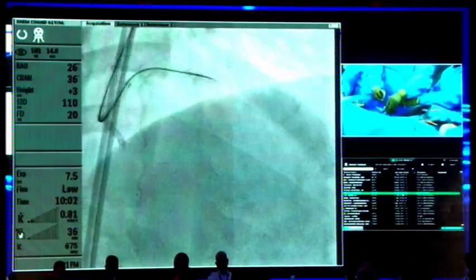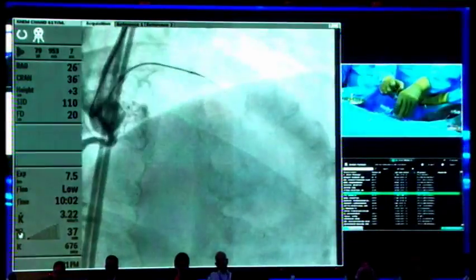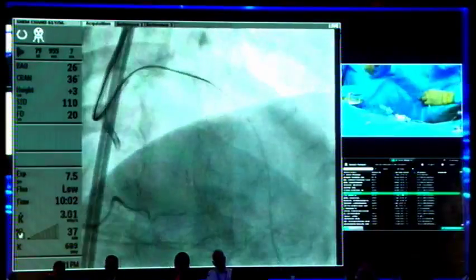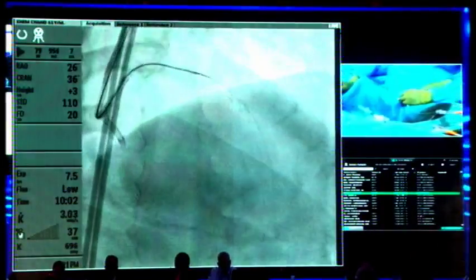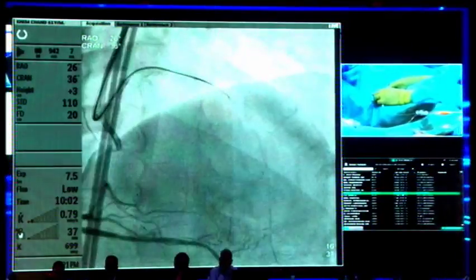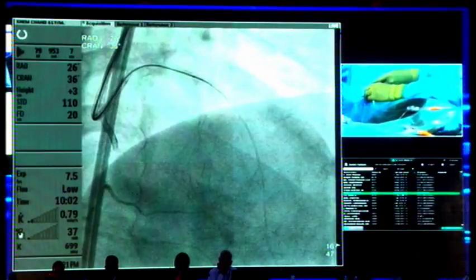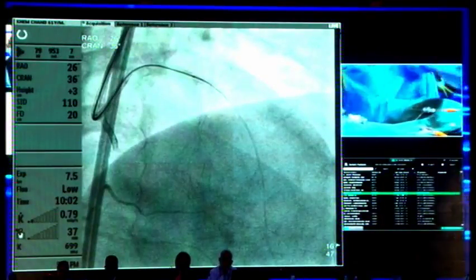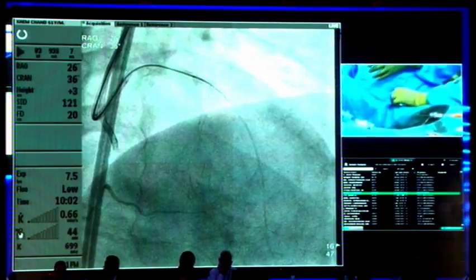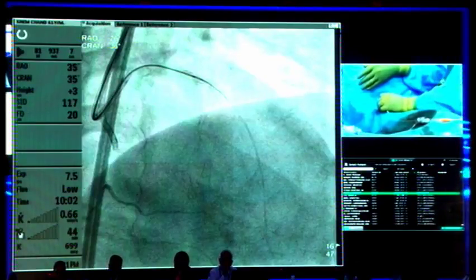So we do the right coronary angiogram to take a picture. We are almost already through it. Very well placed. So this is only one direction, so we are not sure. So we go to the other direction, RAO straight. This vessel seems to be actually underfilled and it will require remodeling. It will go on remodeling and then the vessel size will increase later on. RAO straight, yeah.